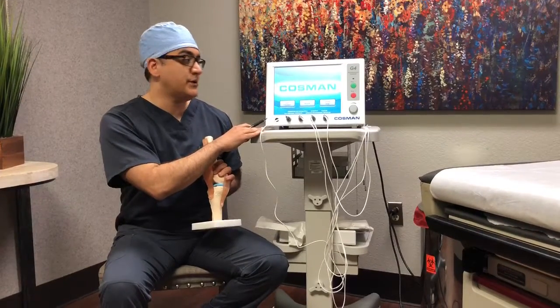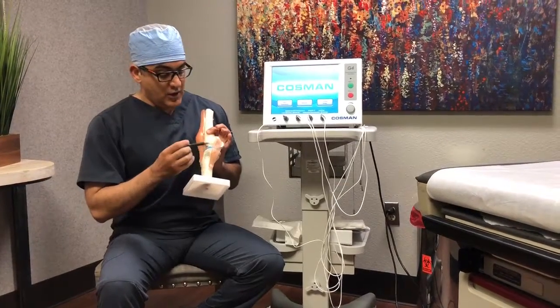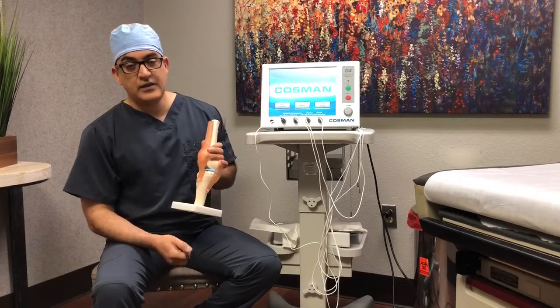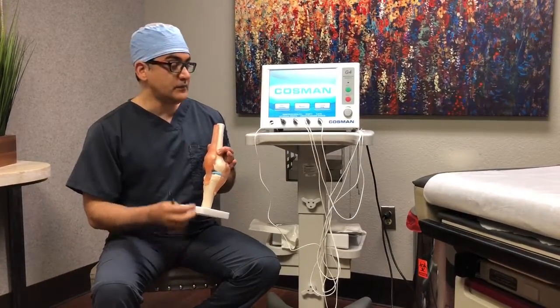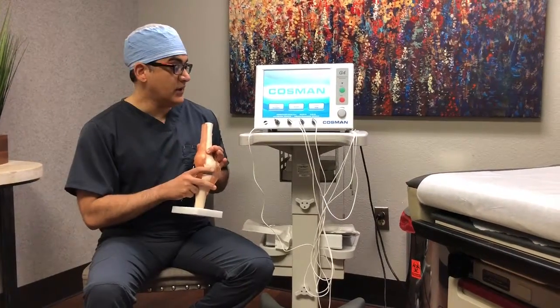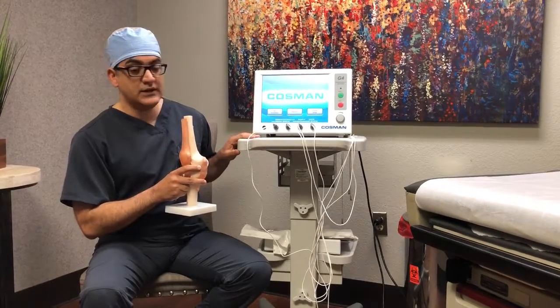We always use a rhizotomy machine. The one I'm showing here is a fourth-generation Cosman rhizotomy machine. We place the needles under x-ray into the target areas where the genicular nerves are.